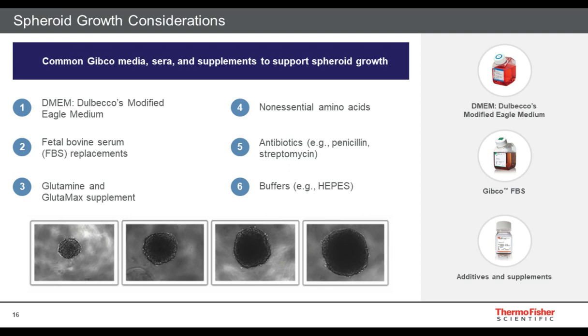In keeping with some considerations for spheroid growth, if you're interested in making spheroids from cell lines or various types of primary cells, typically you don't need any special media. Use what you've already been using, usually some cocktail of DMEM or DMEM-F12 with some fetal bovine serum, reagents that reduce contamination, such as Pen-Strep, anti-anti or Primocin, and supplements like GlutaMAX, things that the cells like.